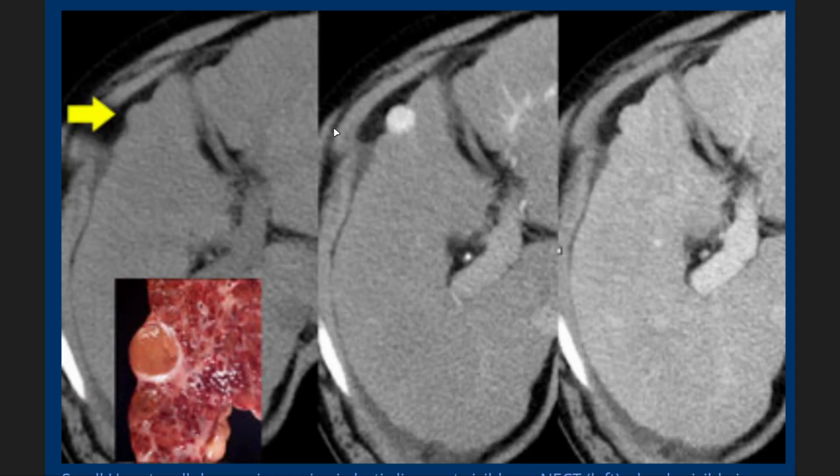30 seconds later. And then this is a very good picture from Radiology Assistant that really explains why the phases are important. So let's assume you have a patient you suspect to have hepatocellular carcinoma, obstructive jaundice, encephalopathy, you name it. And he has hepatitis B virus infection. Classic presentation. And you notice on the CT, I have 3 different phases. I have a CT here without any contrast. I have an arterial phase here, and I have a portovenous phase.